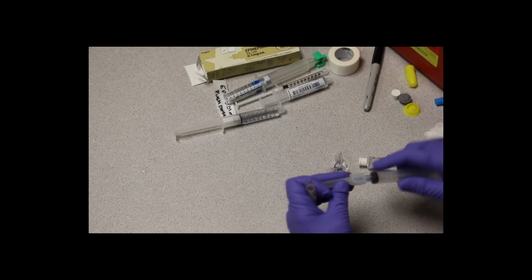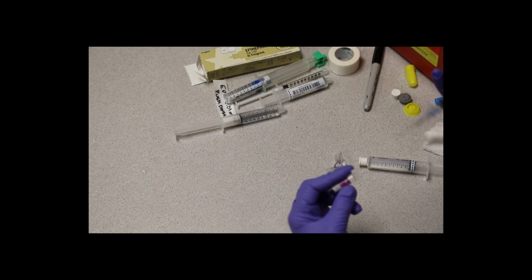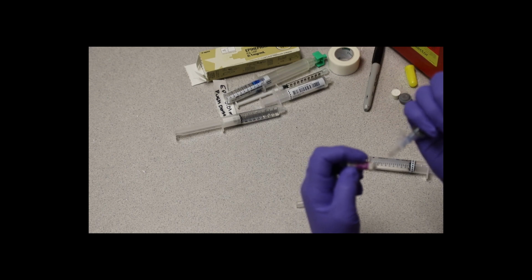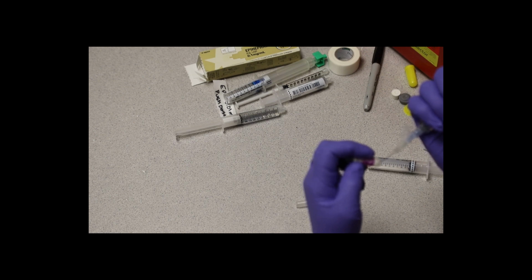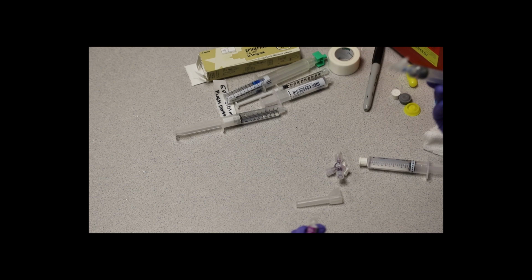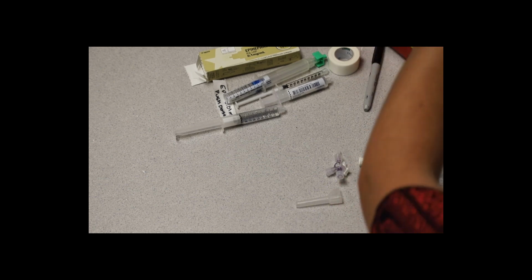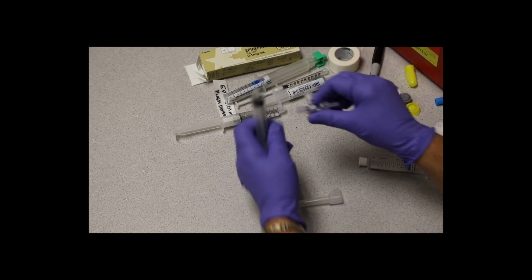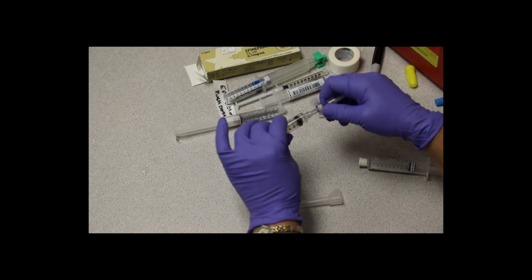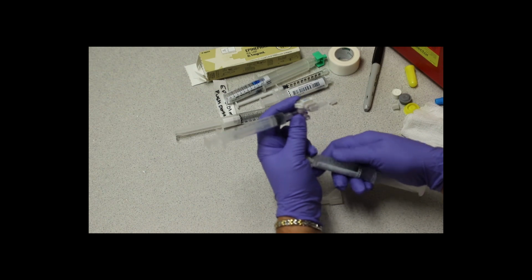So first you're going to take your 10 cc syringe and draw up your 1 ml of epinephrine. Attach your 3-way stopcock. Attach your normal saline.